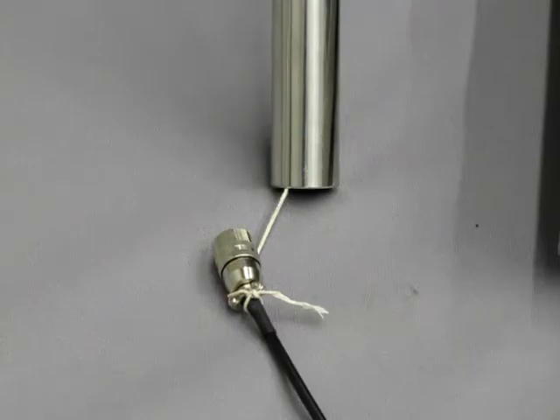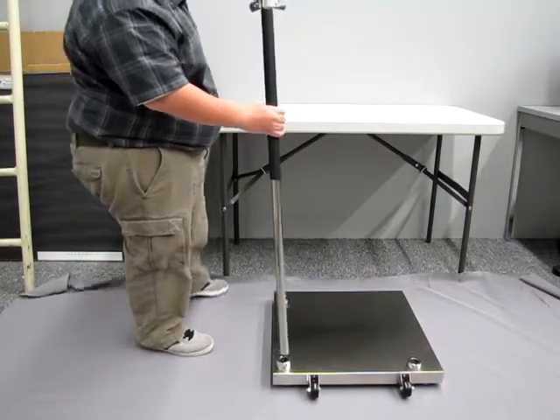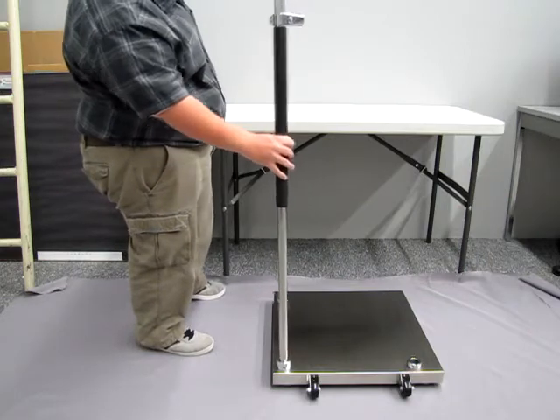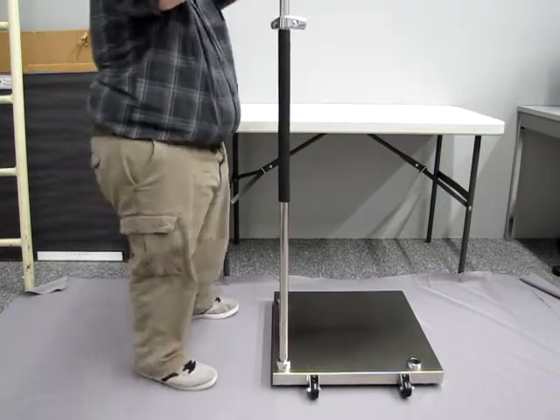It should look like this. Then pull the connector through the column. Be careful when doing so as to not break any of the wires inside of the cable. Use baby powder to help pull the wire up if it won't go smoothly.